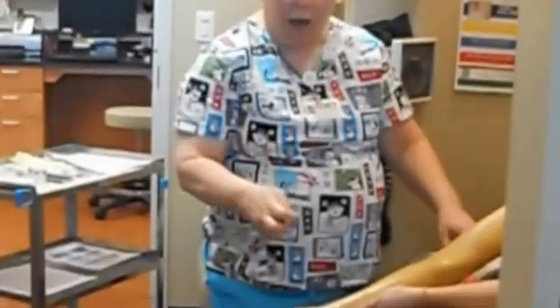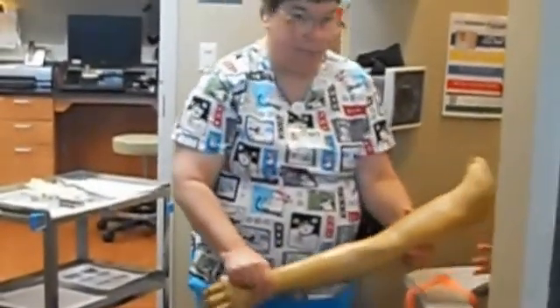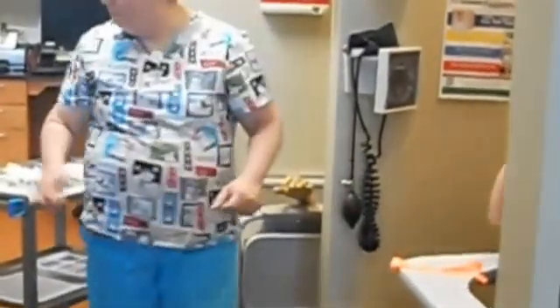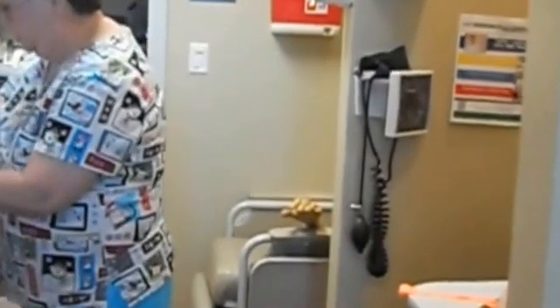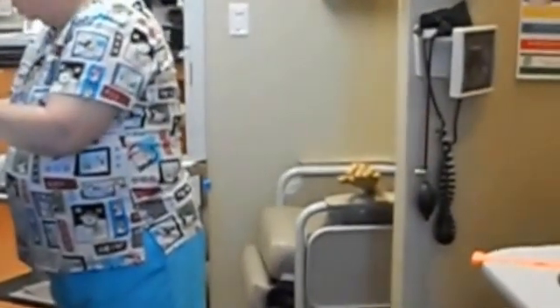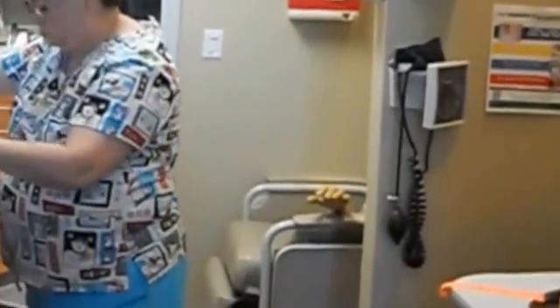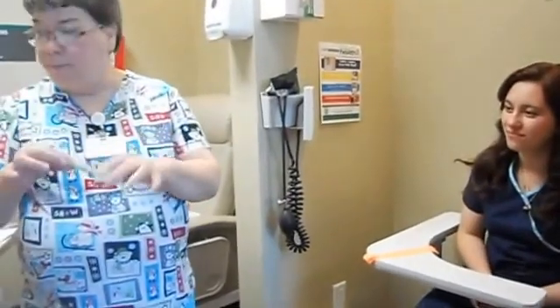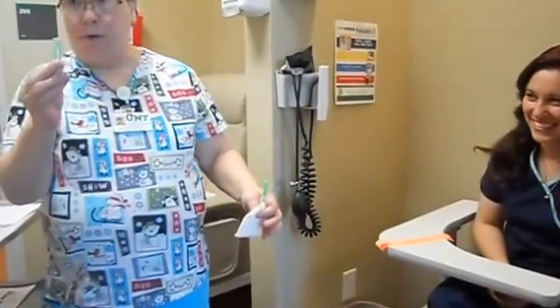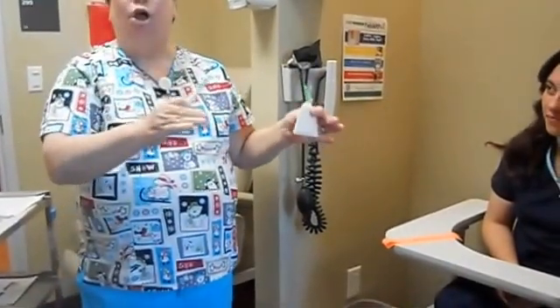Okay. Now we're going to do a live draw. And we're going to draw a green top on our volunteer here. So we're going to get some gauze, our alcohol, a green top, because we're going to do a glucose on her. We have our hub with our needle, our gauze, and our alcohol. Our tourniquet's right here, and here's our tube that we're going to collect. We're going to collect a green top because we're going to run a glucose on it, because later on in the presentation we're going to do a finger stick glucose, and we'll compare the 2 results.